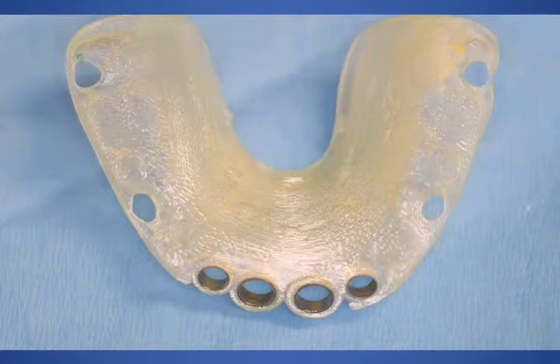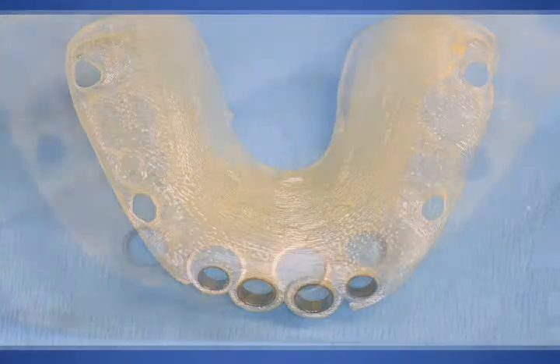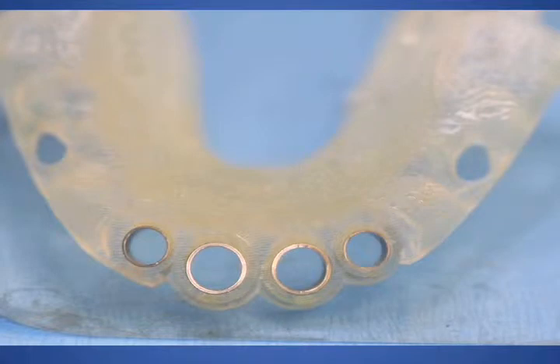Doing the case freehand would obviously create some discrepancy or disharmony and probably would not allow us to load the implants immediately as easily and as predictably as we were able to do in this situation by using a very stable surgical guide. Close-up view of the 4 rings.